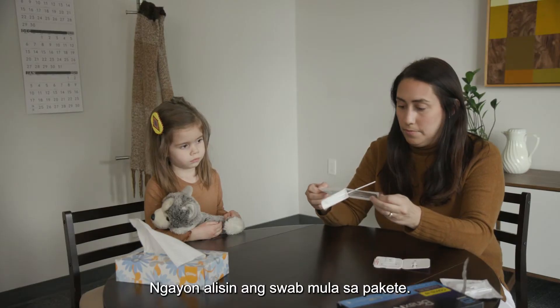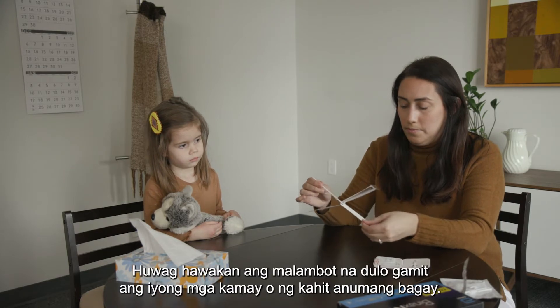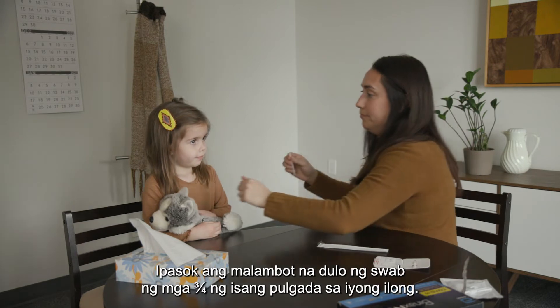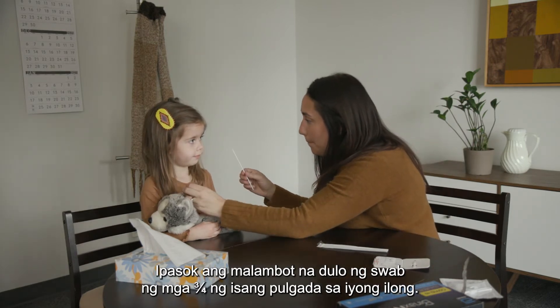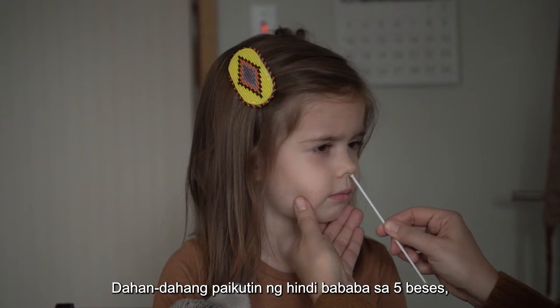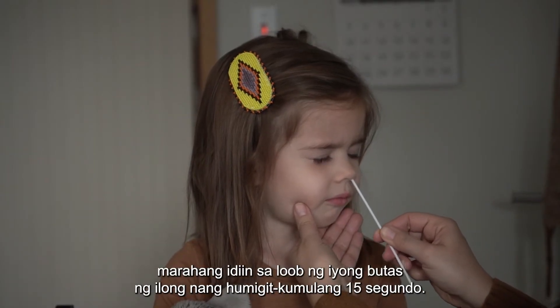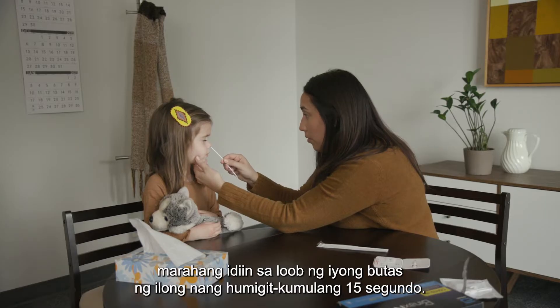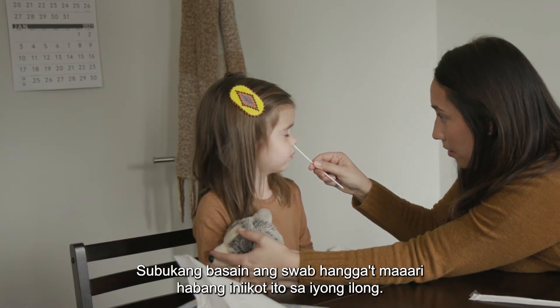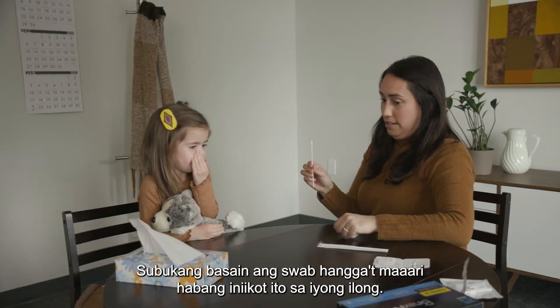Now, remove the swab from the package. Do not touch the soft end with your hands or anything else. Insert the soft end of the swab about three-quarters of an inch into your nose. Slowly rotate at least five times, gently pressing against the inside of your nostril for about 15 seconds. Using the same swab, repeat in your other nostril. Try to get the swab as wet as possible while rotating it in your nose.